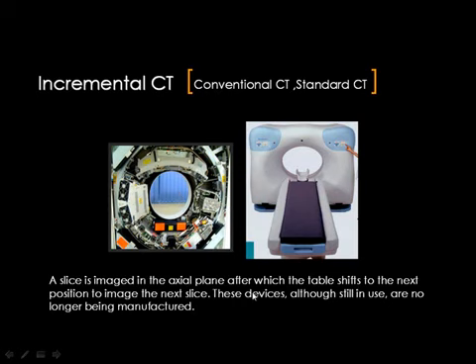machine. In order to have a section in the human body, the tube and the detector should rotate a full circle. And this could not be obtained in the older machines because the tube is connected to the ground by electricity cables. Then the tube has to rotate half a cycle and go back to parking, then rotate the other half cycle and go back to parking. By this motion, 4 motions in order to have a single section in the human body.